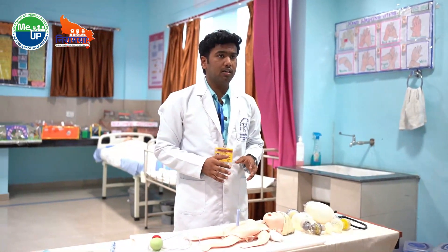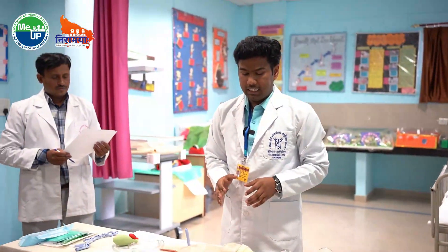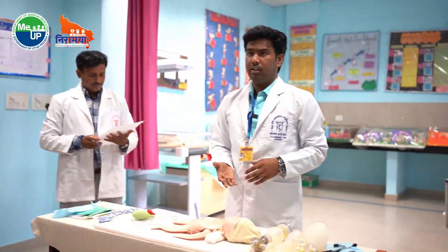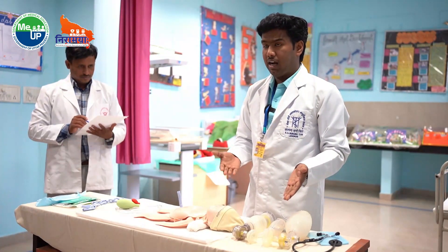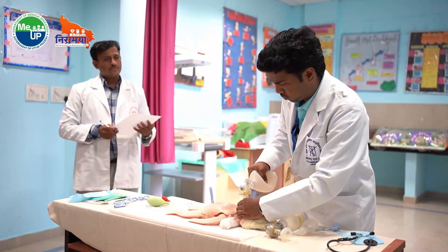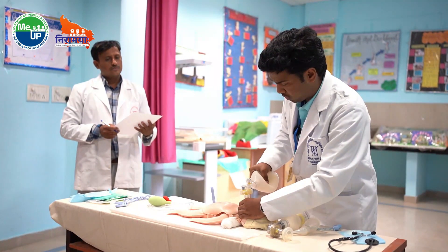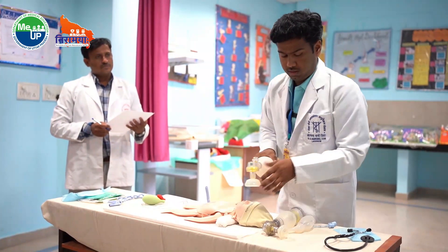If the baby is not breathing well or the heart rate is less than 100, we will again start giving positive pressure ventilation and continue until the heart rate becomes normal — 1, 2, squeeze — 1, 2, squeeze — 1, 2, squeeze.